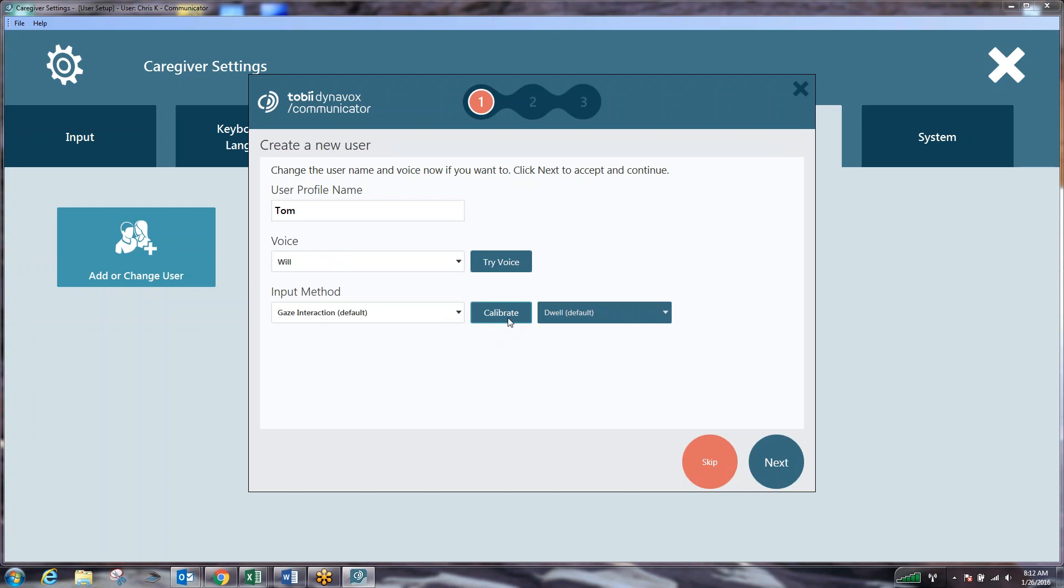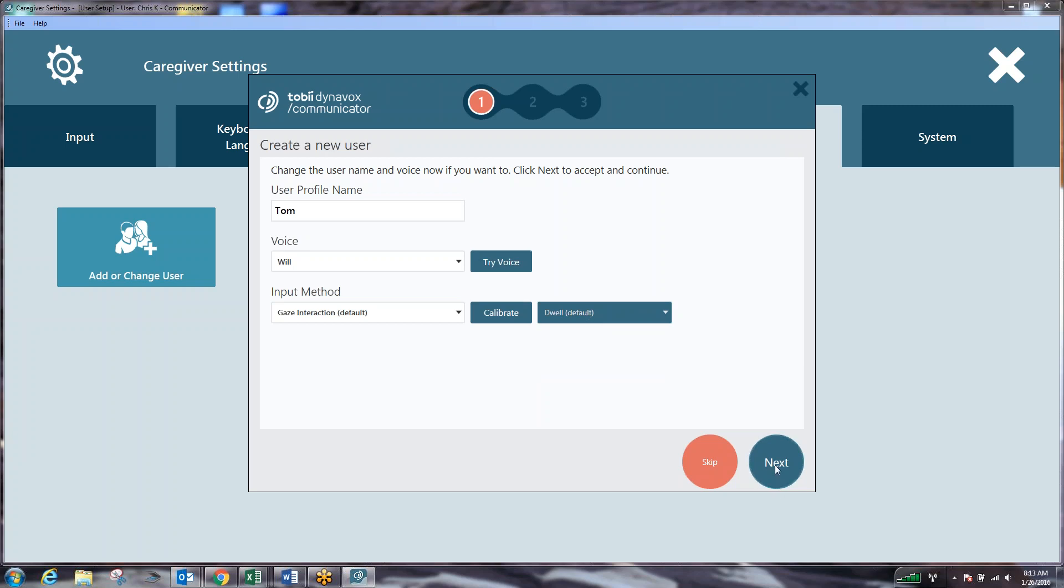Dwell is the selection method used when you are looking at an icon for a certain period of time and once that period elapses it clicks the button for you. Switch allows you to stare at a location on the screen and physically hit a switch with your hand, elbow, knee, or anything else to make the selection. Blink allows you to look at the icon and then make a conscious blinking motion to act as the selection method. The most common is dwell so we're going to stick with dwell and hit next.